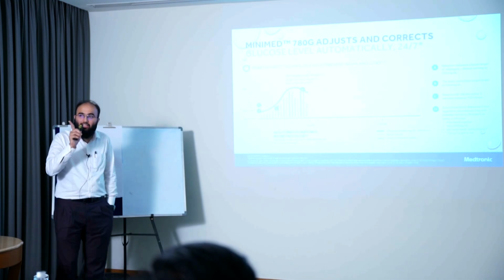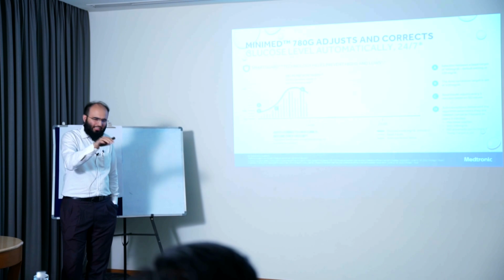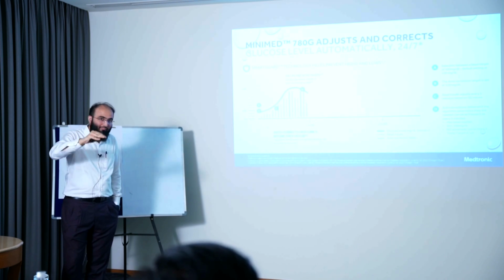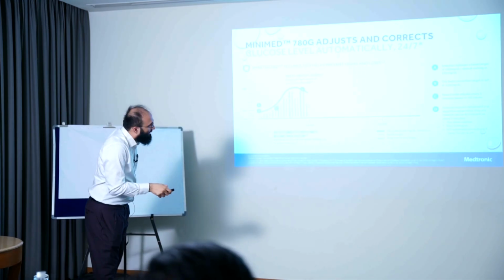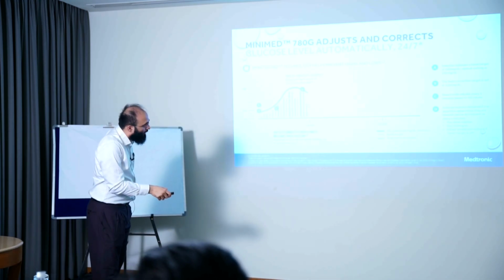Max basal should be reached. You kept max basal. His usual basal is say 1.2. You said max basal is 2 and 2 is being given, yet sugar is touching 180. Then auto correction starts. Max basal is reached. Glucose is more than 120.